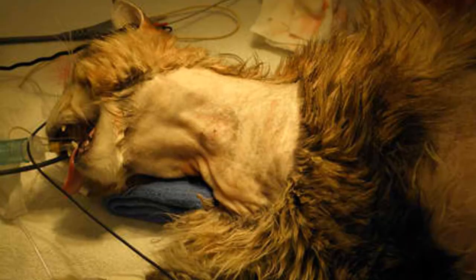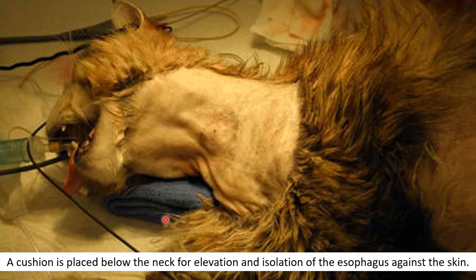After the patient is anesthetized and positioned on its right lateral recumbency, a cushion is placed below the neck for elevation and isolation of the esophagus against the skin. In this particular image, the esophagus cannot be seen yet. We expect it to be around this area. This structure is not the esophagus. Do not cut that area.